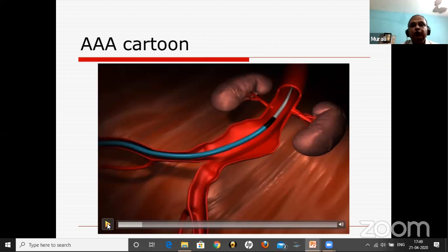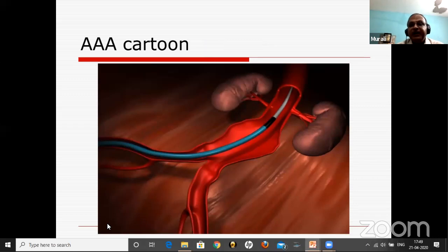So once you go there, now comes the next important step. Now, how do I map the renal arteries? There are multiple ways of doing it. Number one is you do an angiogram injection. The cath lab table has to be perfect, and you mark where the renal artery is with the marker pen on your cath lab screen. Do not move the table. Lock the table perfectly, and then you take the stent.